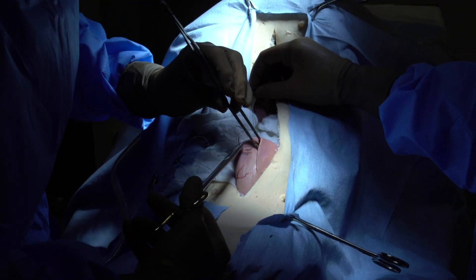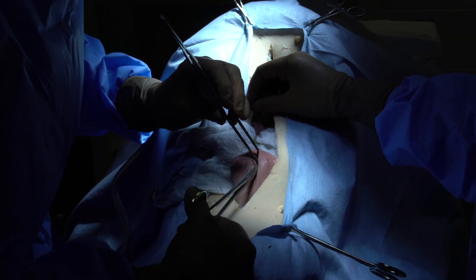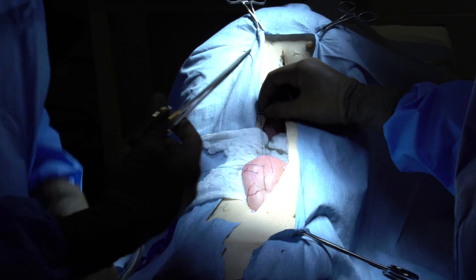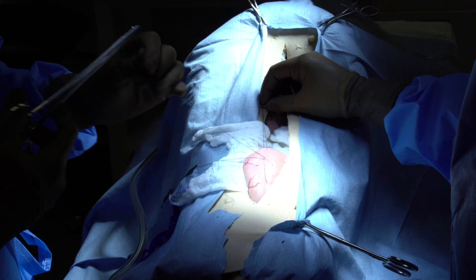When you guys are suturing the bladder, please ensure again you go serosa to mucosa, mucosa to serosa, to ensure that you engage the submucosa.